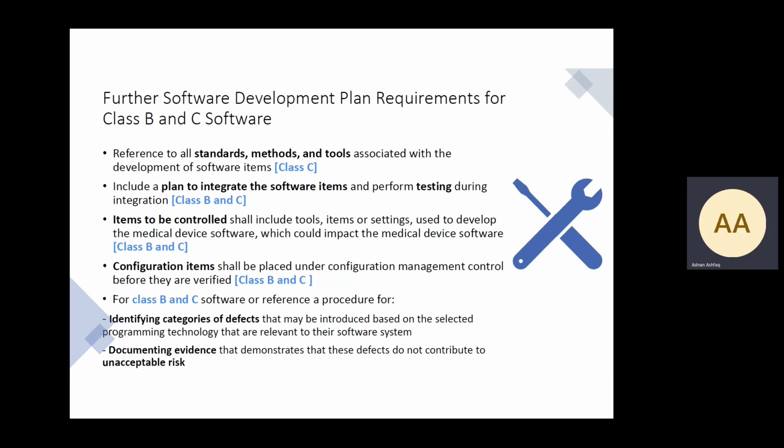The reason I mention individual choice is that in many conversations with developers, it becomes nonsensical not to have some of these documents, and we'll see in some of these examples where it's very important to have documents where the standard says it's for B and C, but doesn't mention it for A. So it's more mandatory for these different classifications.